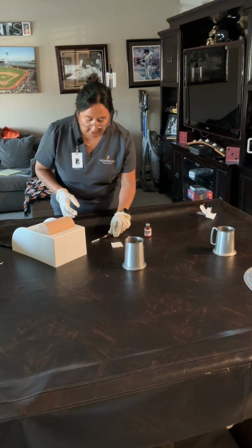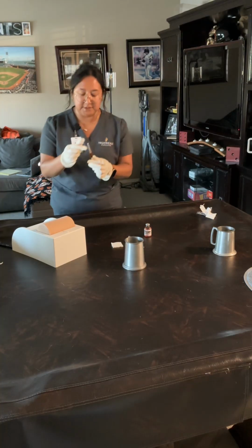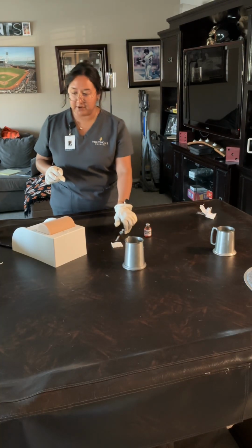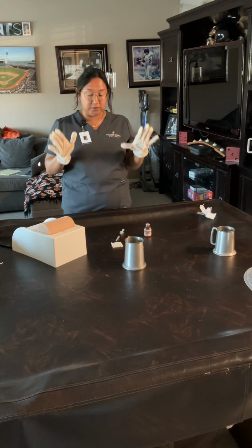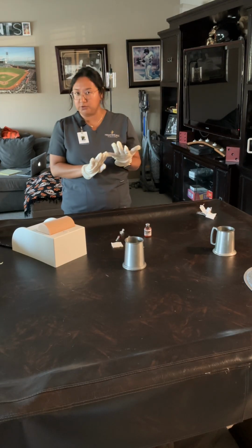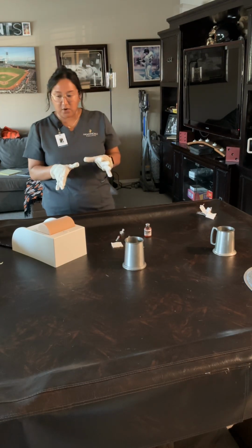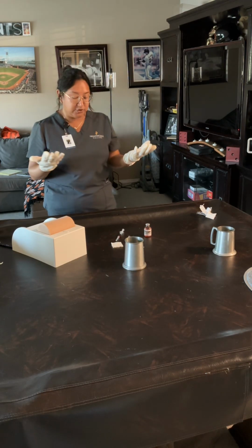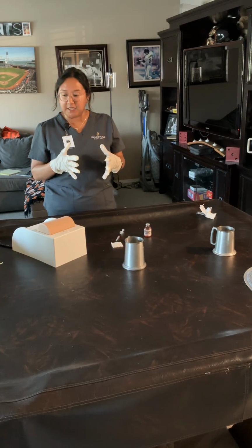Go ahead and close this up with one hand. Go ahead and leave this right here for now. And then I recapped it, and I will double check in the EHR before I start anything: the provider's orders, the medication, the dose, and the MAR, and go ahead and let them know that I will be administering morphine sulfate today. This is just for pain.